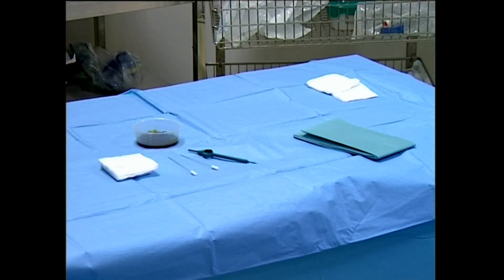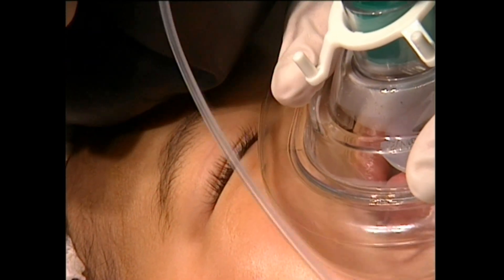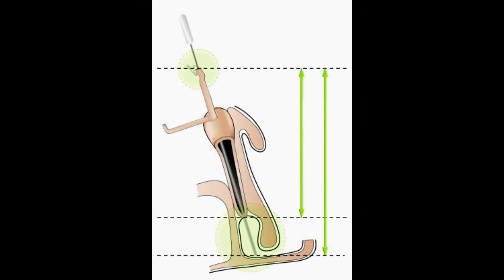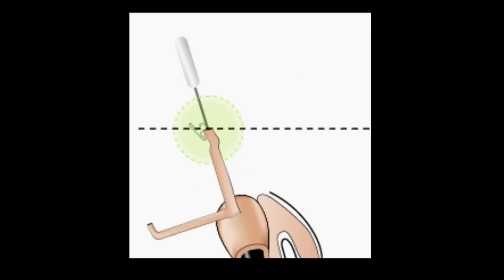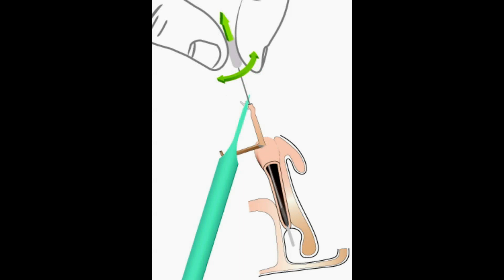Nasal lacrimal duct intubation using the Master Ka is technically comparable to a lacrimal stenting done at any age and requires the usual medical and anesthetic precautions. Careful dilation of the punctum and advancement to bony contact is felt as a hard stop in the lacrimal sac. During the vertical stenting, one should try to continue advancing the Master Ka until the fixation plug reaches the punctal opening. The fixation plug must be held firmly in contact with the punctum throughout the entire process of withdrawing the metallic guide.